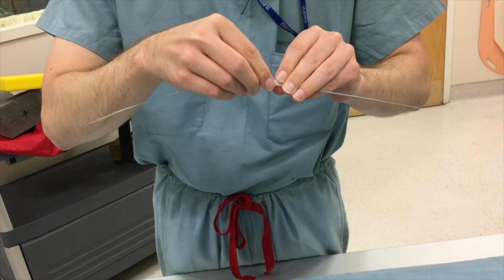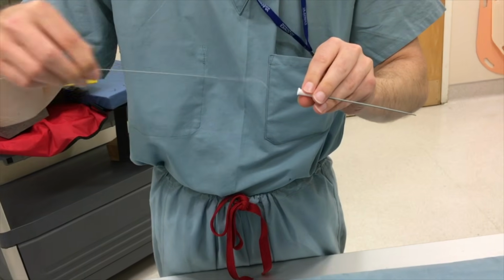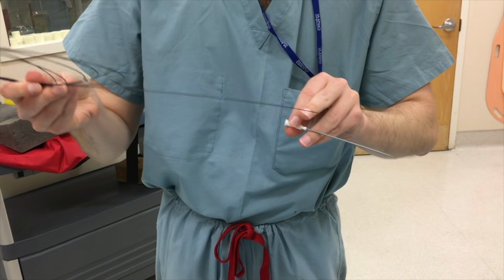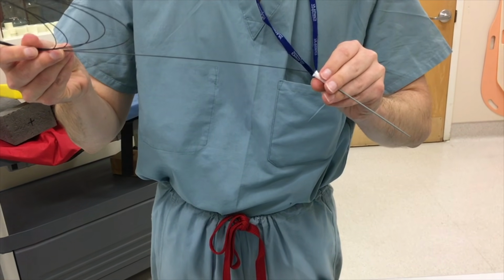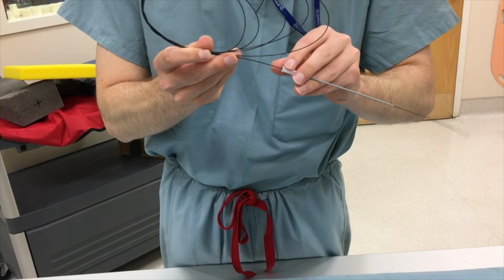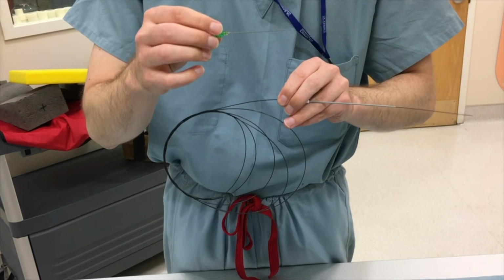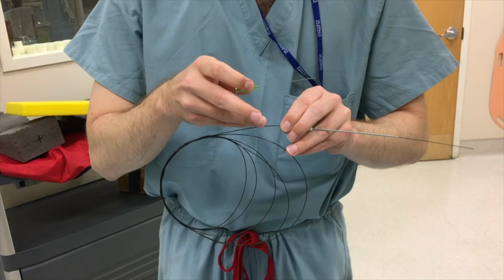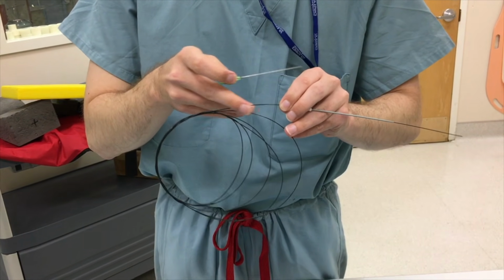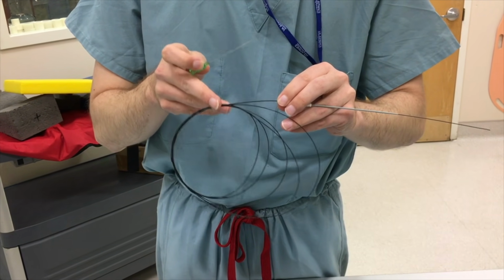So you take out the inner, so here you're still in the arterial system now with a 5 French catheter. You take this out, and now you can take that 0.035 inch wire and get that into your 5 French catheter, and you can get that through. So that's an example of a common exchange where you puncture the arterial system with something which is 21 gauge and can't necessarily fit a 0.035 inch wire, and you exchange up to a 5 French catheter, and now you can get this wire in there.